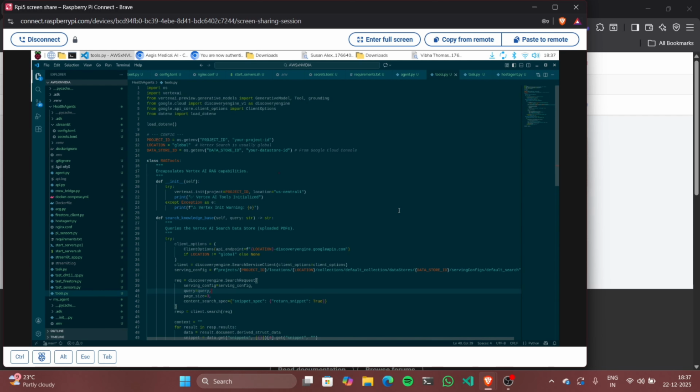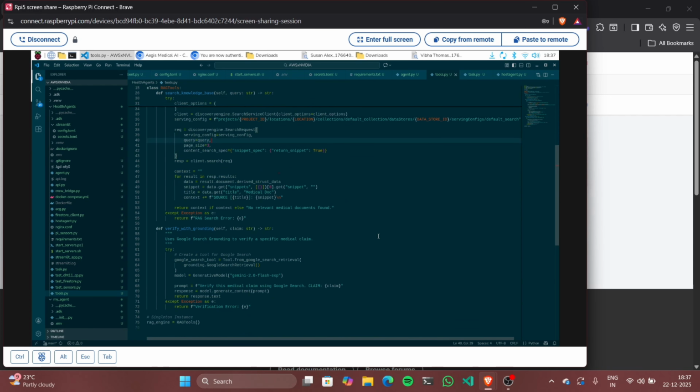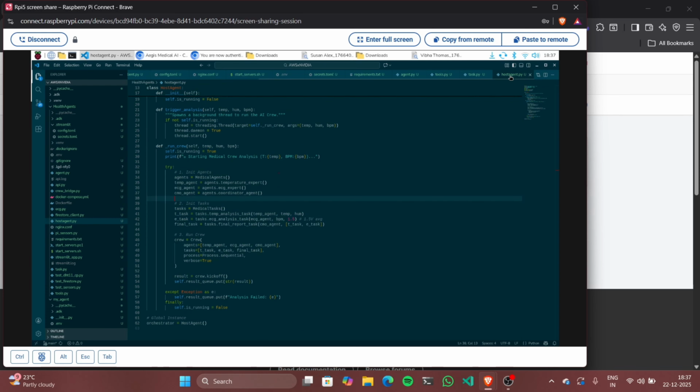Next, coming to the tools that I use. So to verify our AI resource, we implement RAG through Vertex AI. So we have a legitimate resource and make our AI very reliable.